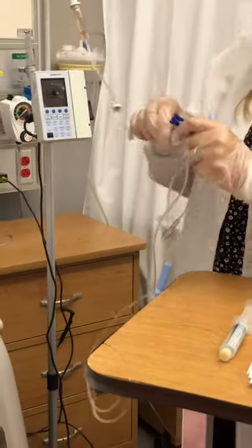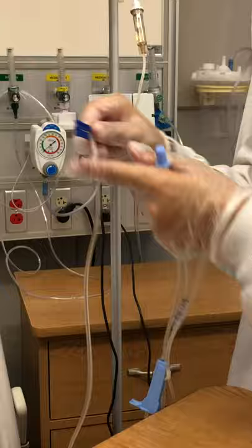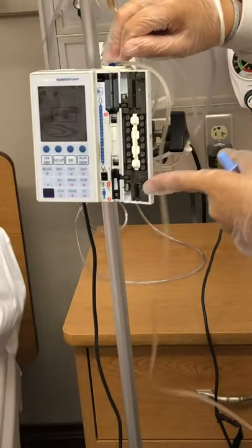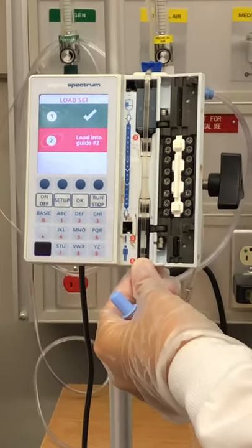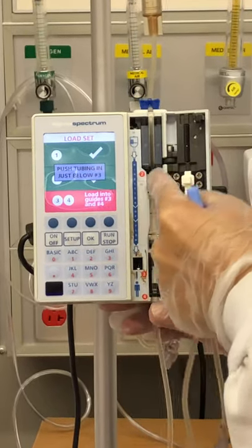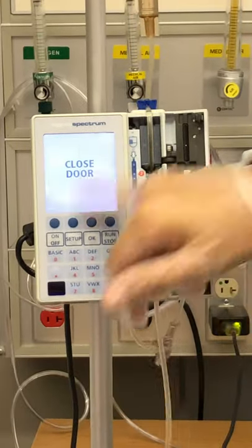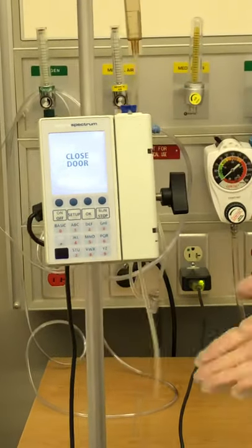The Baxter pump is a little different — it comes with this blue clamp that works like a key, and that's how we open the pump to load the tubing. You insert the clamp and it opens up this door, and then it tells you what to do right on the screen. There are a couple of numbered places where you have to make sure the tubing is seated. Number two is already in; for number three and four, you just push it in until the screen turns green. Then you close the door and your tubing is loaded.